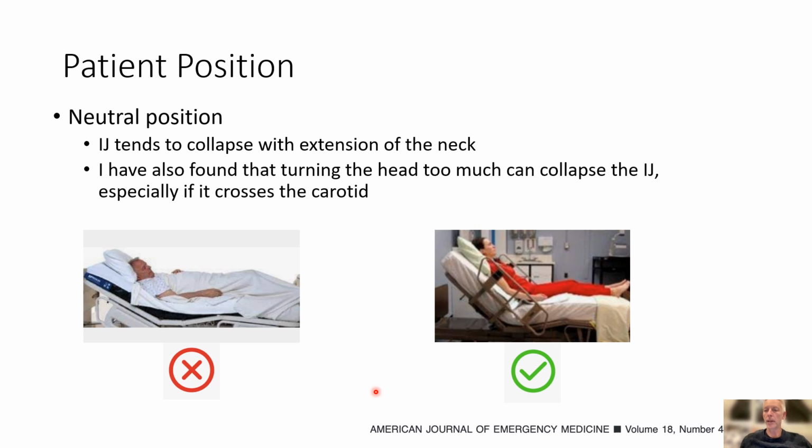In other words, the patient should not turn their head and should be lying on their back with their backside snugly fixed to the angle of the bed. In general, this means that patients will often need to be hoisted up the bed before scanning the JVP. I will often take my first look with the head of the bed flat, for reasons that I will get into in a moment. Although if I'm expecting a grossly elevated JVP, I will usually begin with someone in a more upright position.